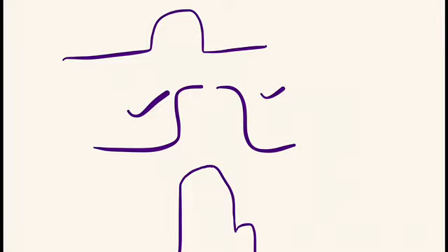Any change in the muscle mass of the atrium or ventricle will increase or decrease the depolarization wave if there is an increase or decrease in muscle mass respectively. So this was how the P wave will show us if there is right atrial hypertrophy.